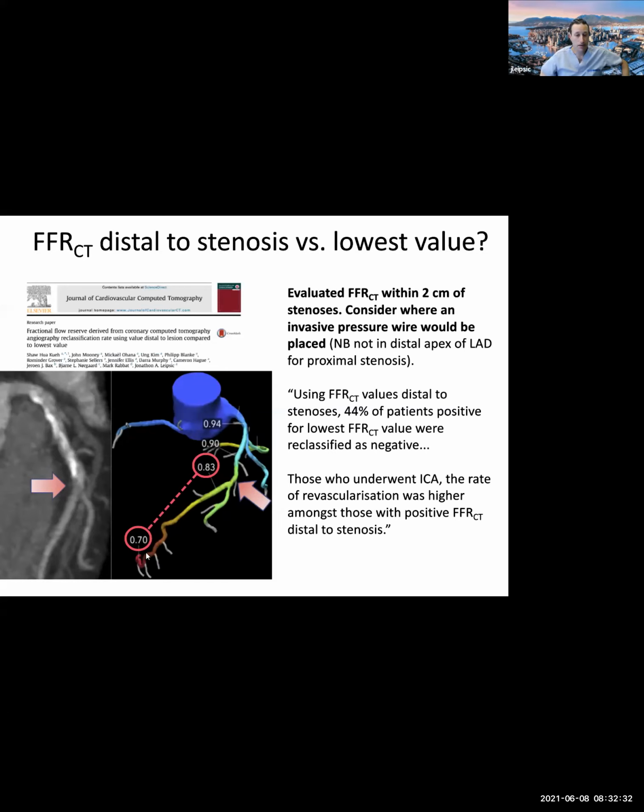Now, people will ask me, what does this 0.70 mean? Well, what this means is this patient is not well, right? Johnny Goudreau would not have an FFRCT value, I've never imaged him, I'm not breaking HIPAA, and I know it's recorded, but he would not have an FFRCT in his distal LAD of 0.70, right? This is a reflection of poor vascular health, typically poor vasodilatory capacity, low coronary volume to mass, or diffuse plaque. But this value is not a value that should be used to guide decisions around cath lab referral.